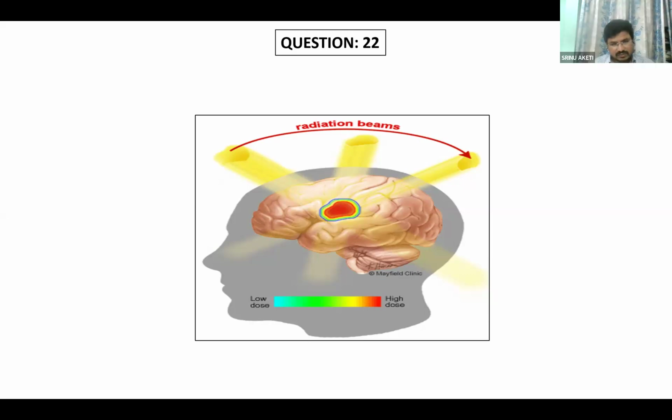Very good. We have to use special immobilization which gives less than 1 mm deviation. Yes, sir. In our institute we use the CyberKnife machine, so for a brain tumor the tracking will be skull tracking itself, sir. We will give margins mostly less than 2 mm, sir.